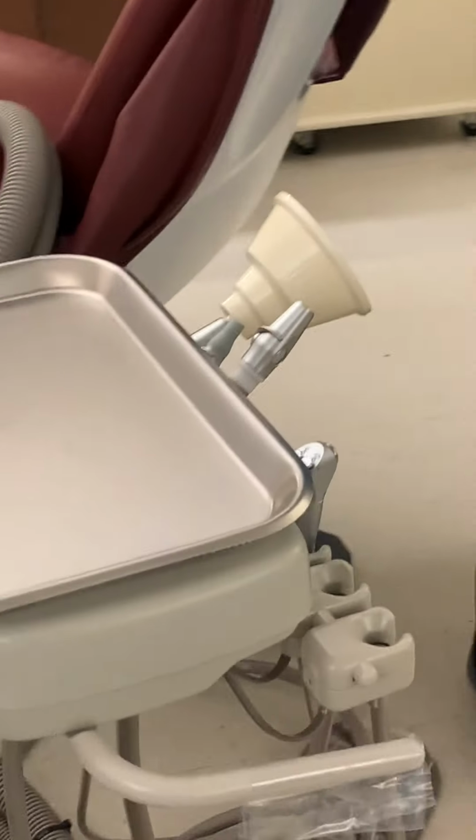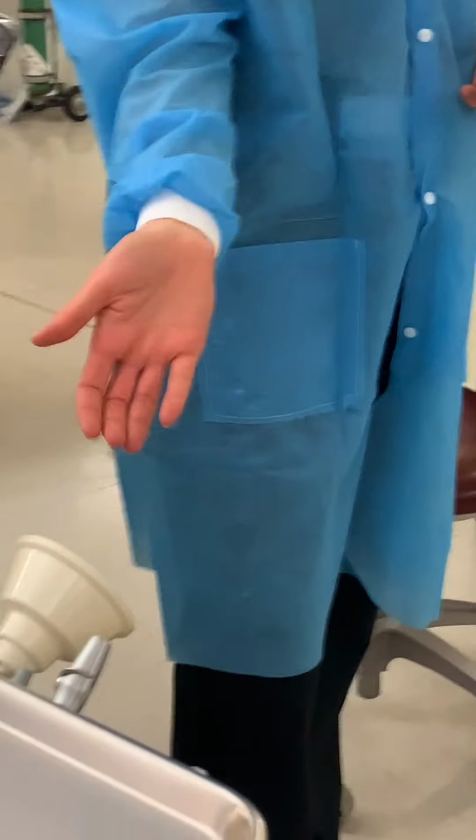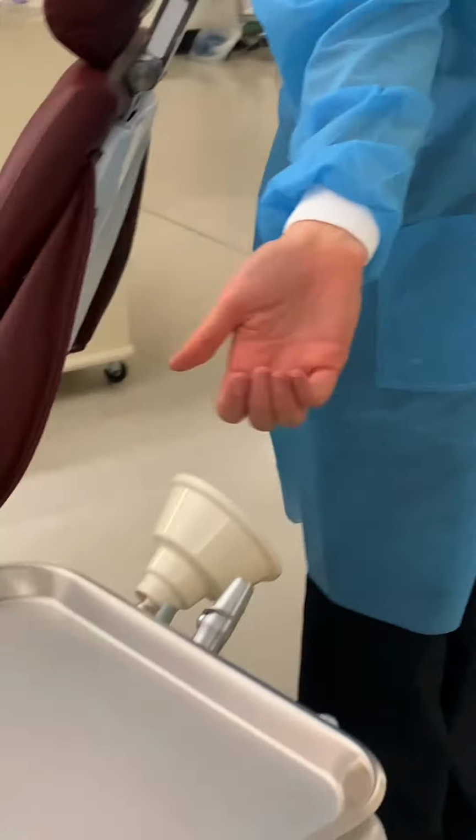But if it's something where you know you're going to turn it on and off during the procedure, you would barrier the on-off switch too. But for our purposes, we'll say it's already on, and it would stay on all day. And let's say at the end of the day, you would turn it off with a clean hand. It's not contaminated.